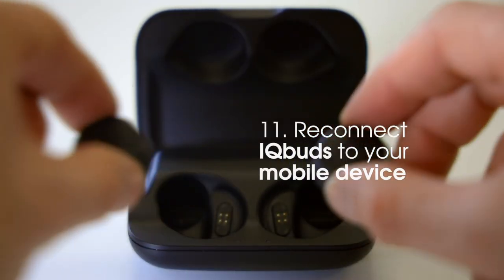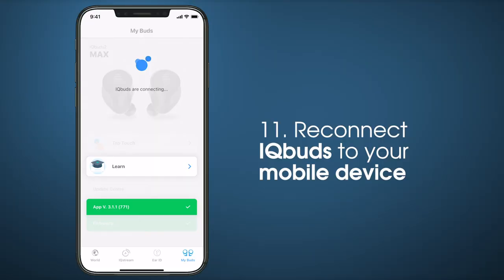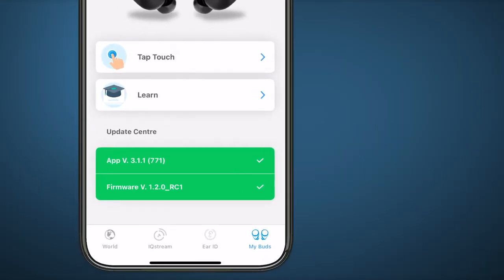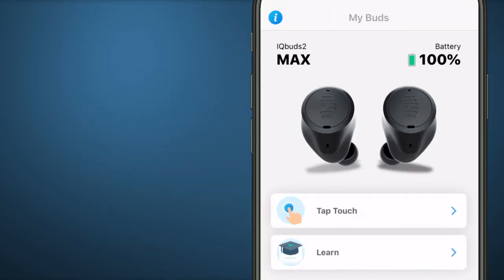Reconnect your IQbuds to your mobile device. The My Buds Update Center should now show that the firmware version is up to date.